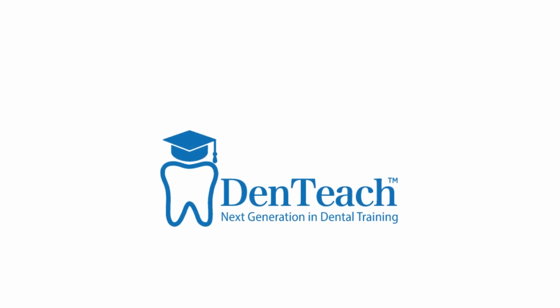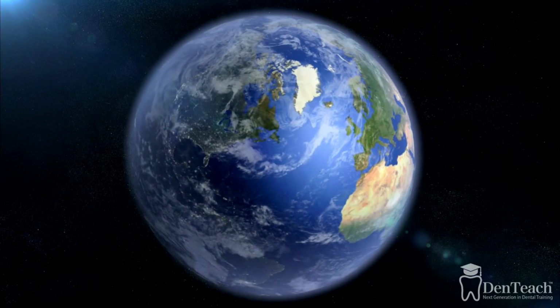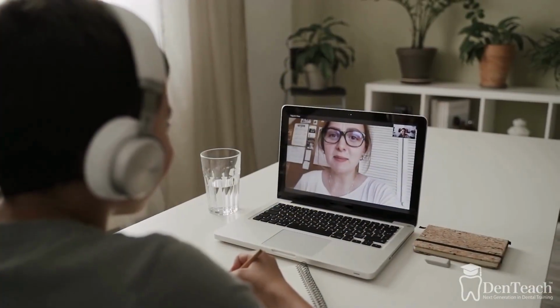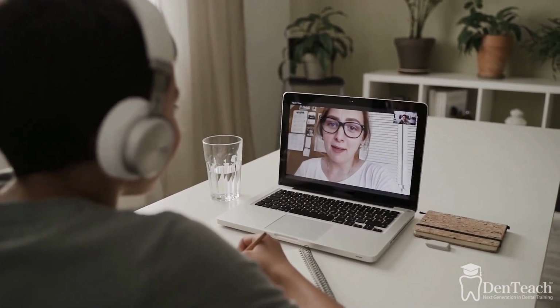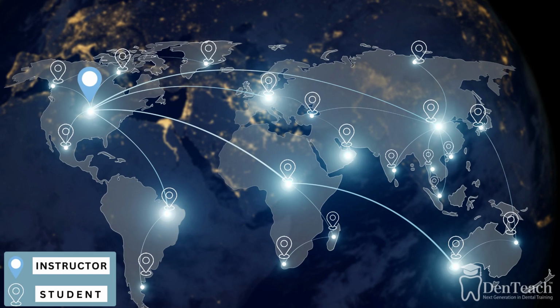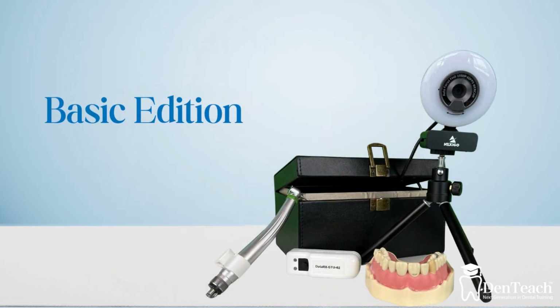We are excited to show you our revolutionary product that will change the world of dental education. With DenTeach, students will be able to have classroom experience from almost anywhere. To demonstrate this, we will now show you an example of a live class session that can take place from multiple different locations. The two main components of DenTeach are the DT Instructor and the DT Student.